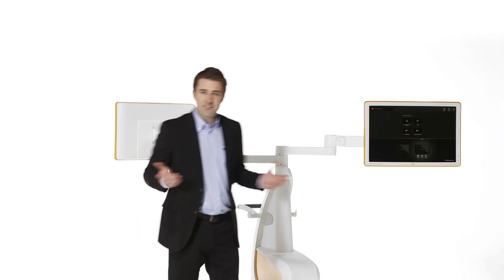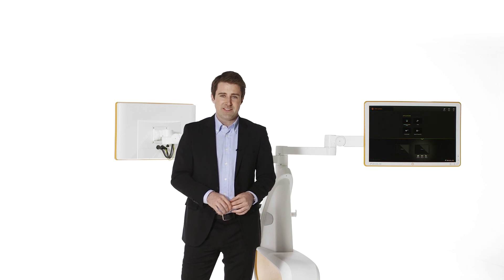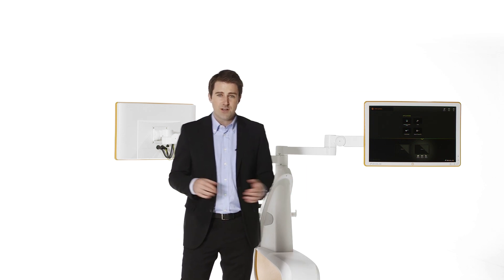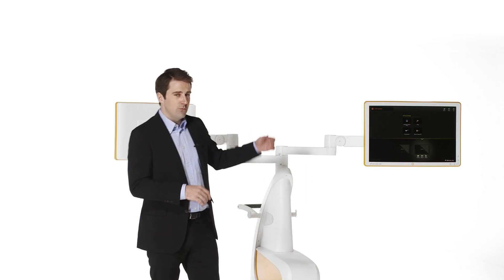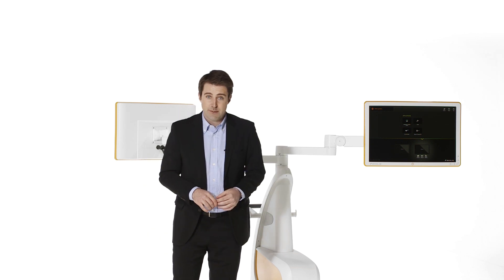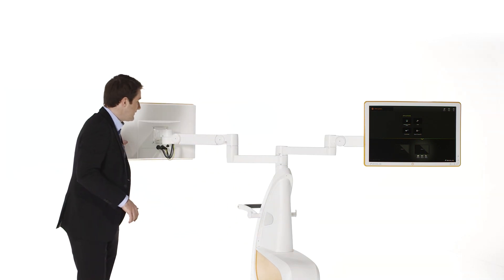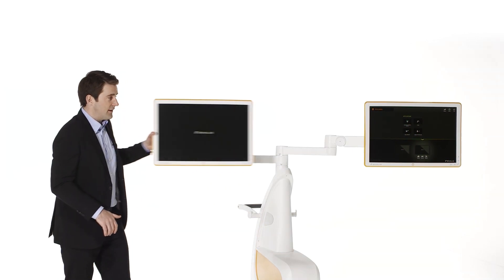This position flexibility extends beyond the sterile field, even allowing one display to be used by the surgeon with a sterile touch pen, while the other display is operated by the non-sterile team.